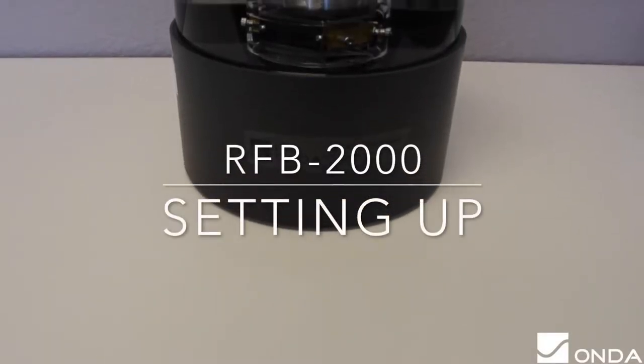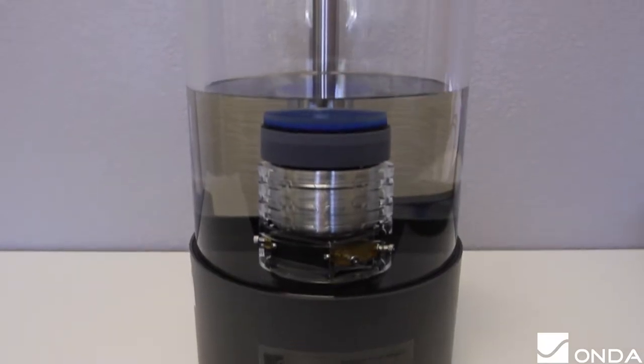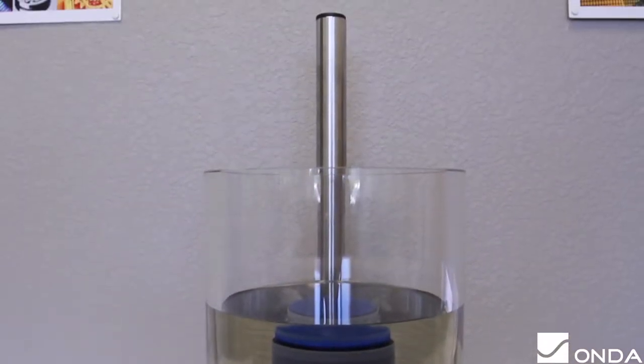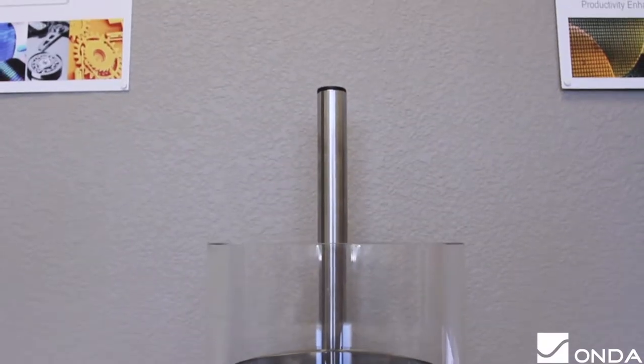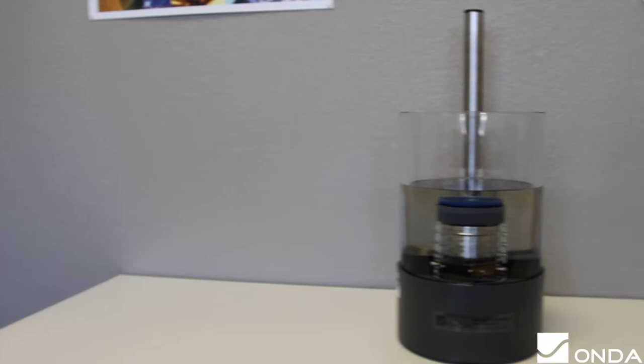The ONDA RFB-2000 is designed specifically for the measurement of ultrasound power and easily handles a wide range of diagnostic, physiotherapy, HIFU ultrasound products, and laboratory devices without requiring extensive need for correction factors.